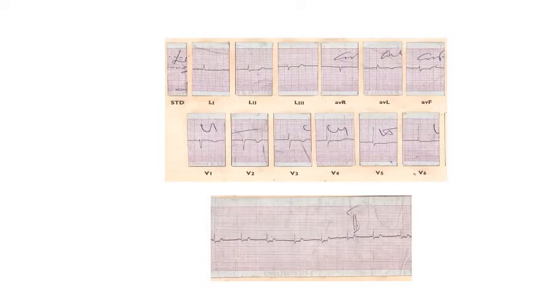And there is ST-T depression in 2, 3, aVF with T inversions in 1 and aVL. And there is T inversion in V3 to V6, V3, V4, V5, V6. Okay, yes.